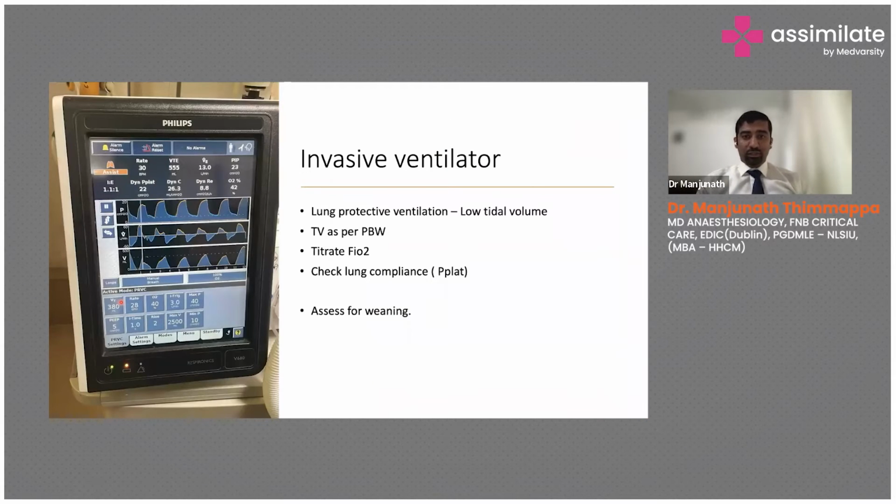Now the invasive ventilator, which we all know. In lung protective ventilation, if I talk about ARDS, it by itself will take 1 day. But here we'll go as simply as possible about monitoring, support and low tidal volume ventilation, where we set the tidal volume according to the predicted body weight. The predicted body weight is according to the height of the patient. It is not the weight of the patient. It is the height of the patient.